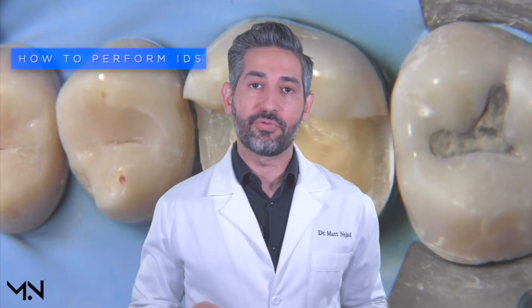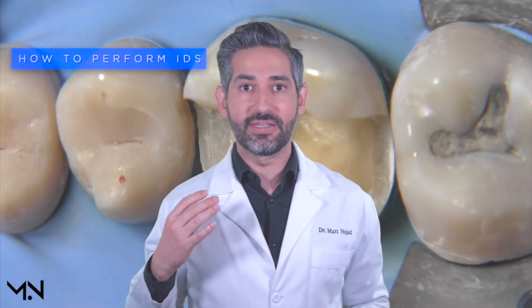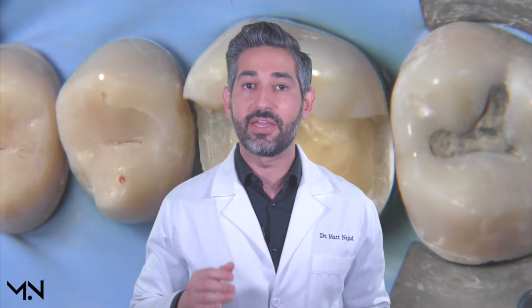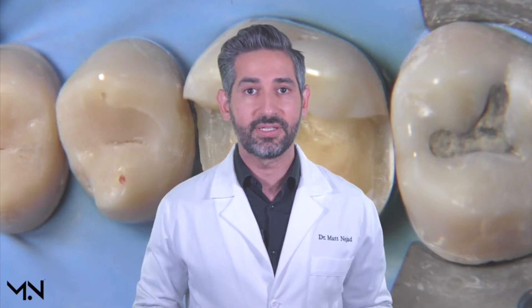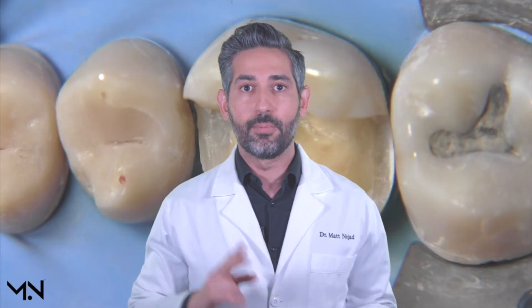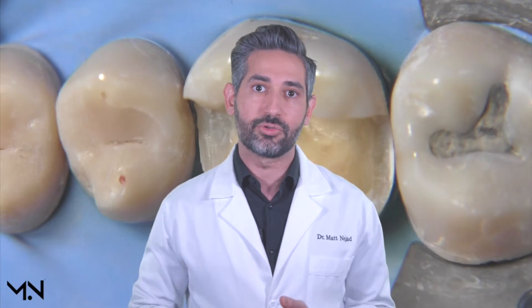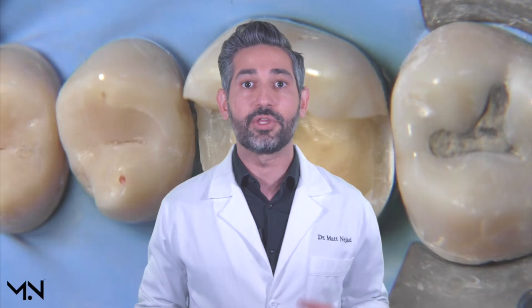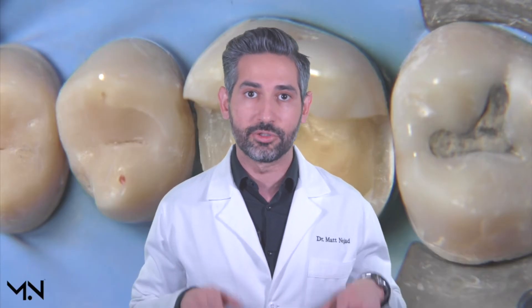Now we're going to cover how to perform immediate dentin sealing with a step-by-step video demonstration. At this point you need to make sure your preparation is completed and that you have adequate isolation in place. Adequate isolation is so important for maintaining a contamination-free working environment free of moisture, saliva, and any sort of debris. I highly recommend the rubber dam for optimal results.